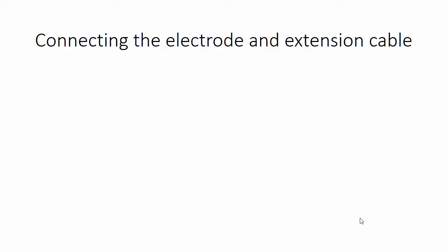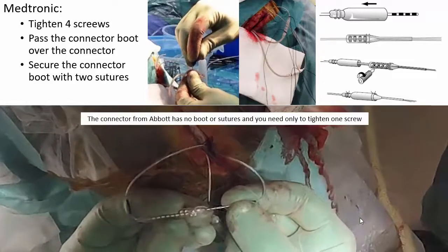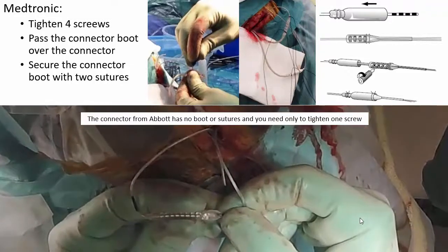When connecting the electrode and extension cable, with Medtronic you tighten four screws, pass the connector boot over the connector, and secure the connector boot with two sutures. With Abbott, there is no boot or sutures — you need only to tighten one single screw.